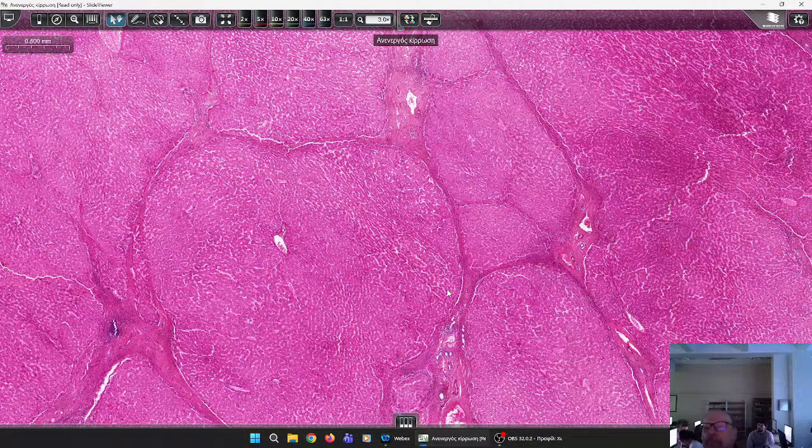Most cirrhotic livers that we receive, especially explants, and many times in the biopsy, you cannot define the offending agent, what caused the cirrhosis in the first place. This is called a burnout cirrhosis. This is very interesting because you can see a cirrhosis induced by MASLD, metabolic associated liver disease, that is so burnout that you can't even see steatosis.